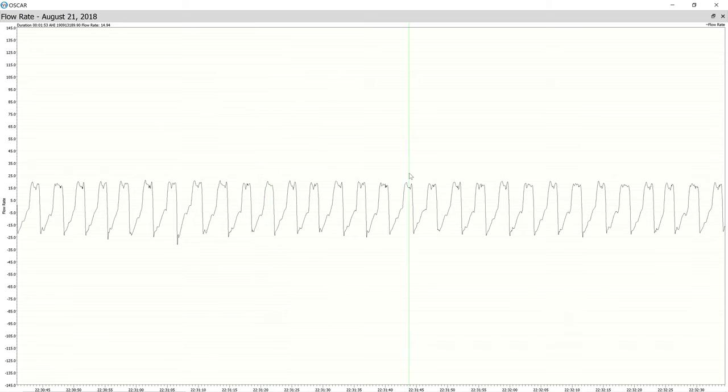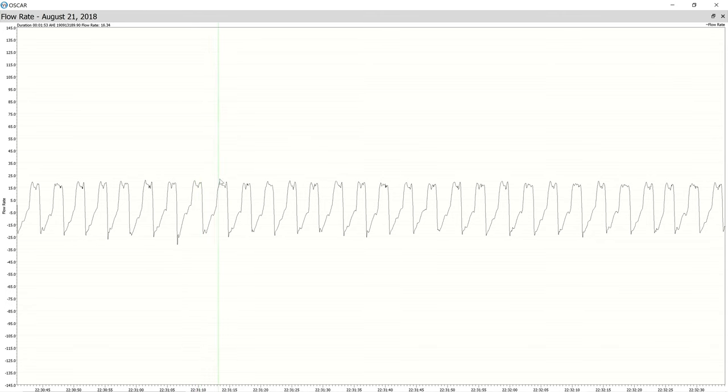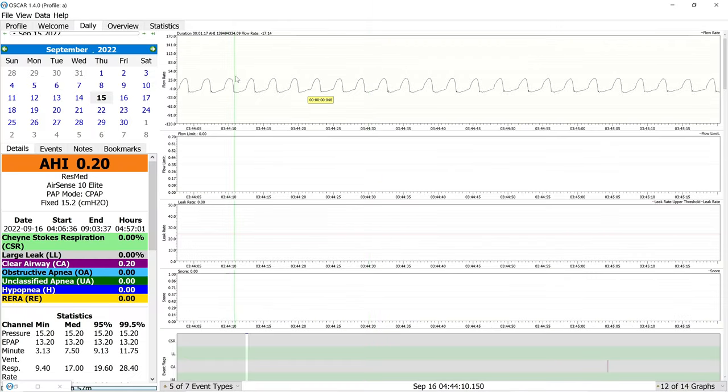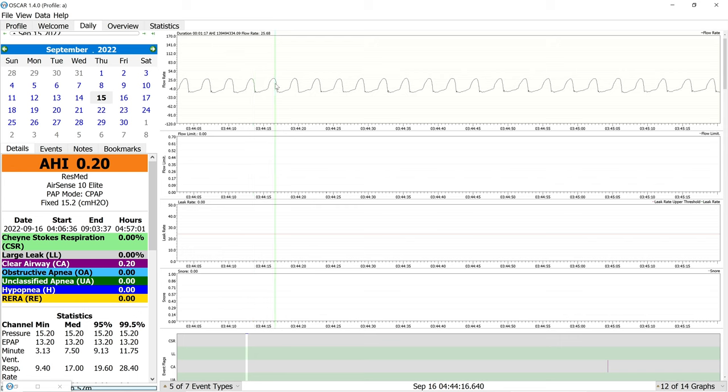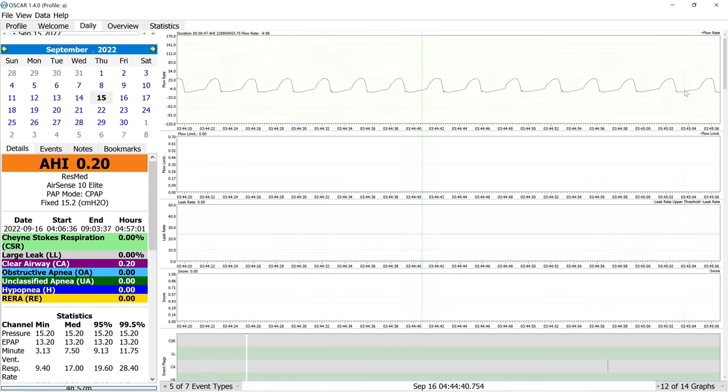And let me say, too, just before we jump into the graphs, that there isn't exactly absence of evidence. There is a burgeoning pool of literature that's centered around answering this exact question. So for those of you who aren't really sure what I'm talking about, when I say flow limitation, what I'm talking about is the tops of these breaths. You can see that these breaths, they're flattened. They have little peaks to them. Some of them multiple peaks, some less than or more than others. But in the end, they all share the same fundamental quality of them being abnormal. I've gone over this concept in previous videos, which you can find on the channel, but these are what normal breaths look like. Do you see how the breath has a very rounded, consistently rounded top to it? And there are no little peaks and whatnot like we saw in the last one.